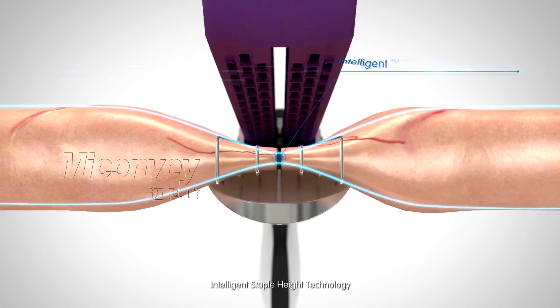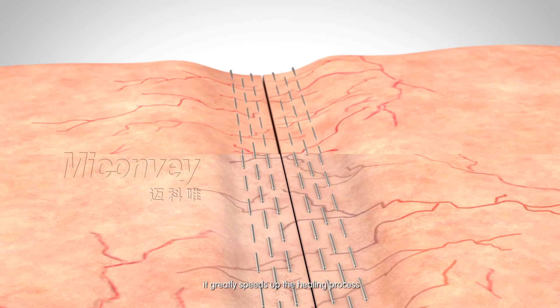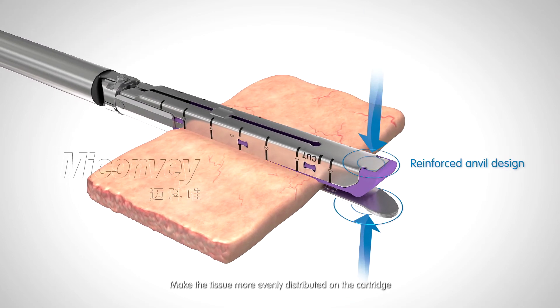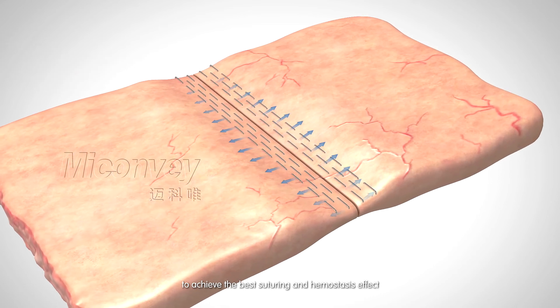Intelligent Staple Height Technology. Achieving perfect performance in suturing and hemostasis, it greatly speeds up the healing process. Reinforced anvil design makes the tissue more evenly distributed on the cartridge to achieve the best suturing and hemostasis effect.